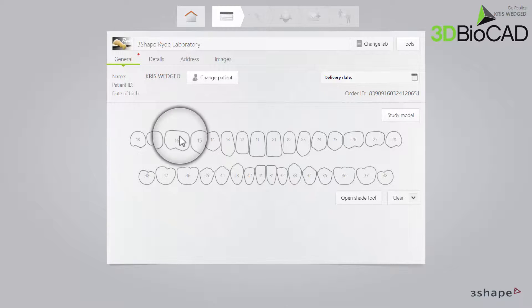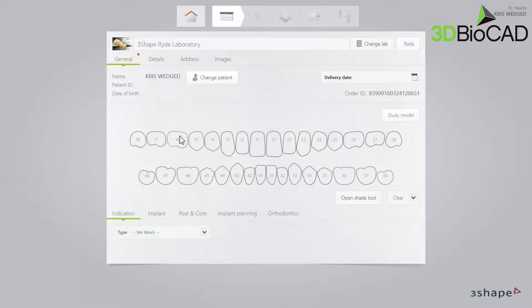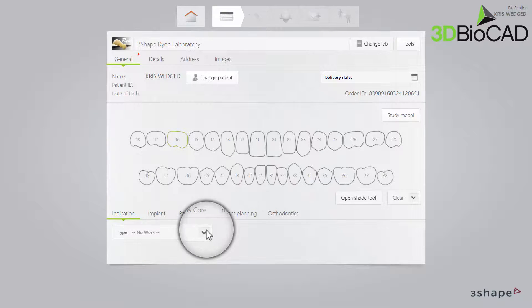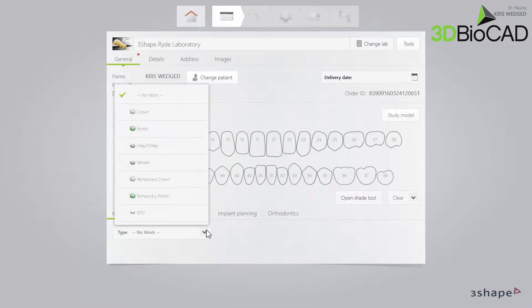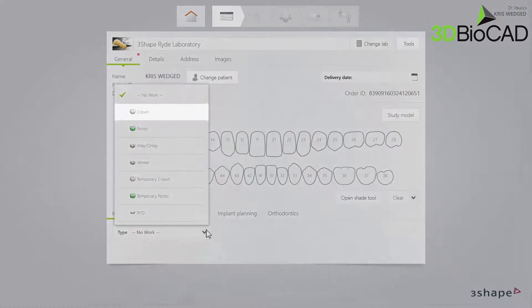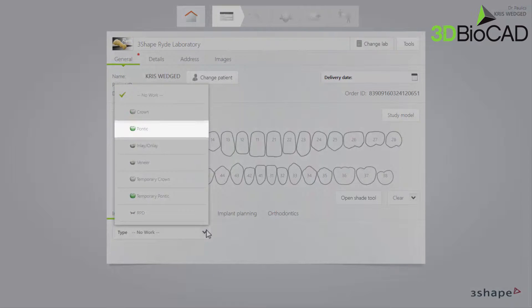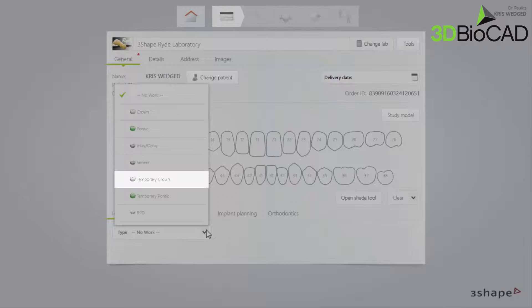Mark the tooth that needs to be restored. The tooth will be outlined in green. The Indication tab will open at the bottom of the window. In this case, we are planning to make a single crown. Click on the Type drop-down list to select a crown. You can select either crown or temporary crown, depending on your needs.